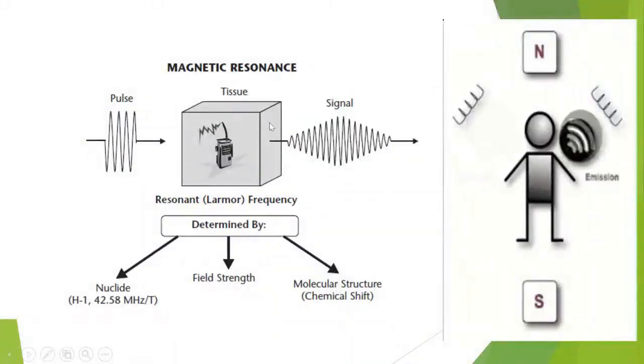The whole idea is that I have a proton in the tissue and I give it a signal. Then I stop it and the tissue starts to respond. I receive this signal and translate it into images, the same images that we see here. I will clarify these processes.